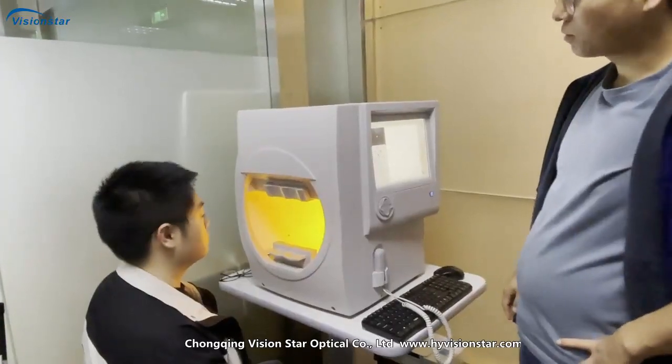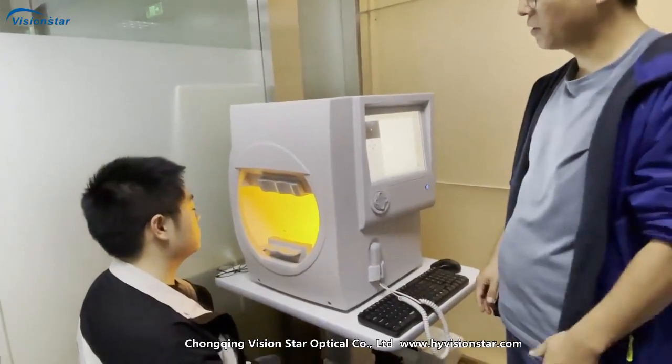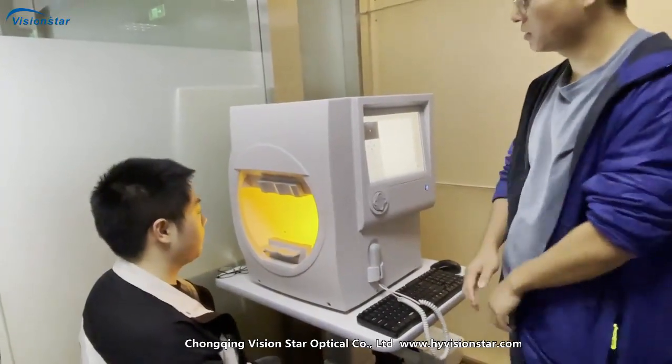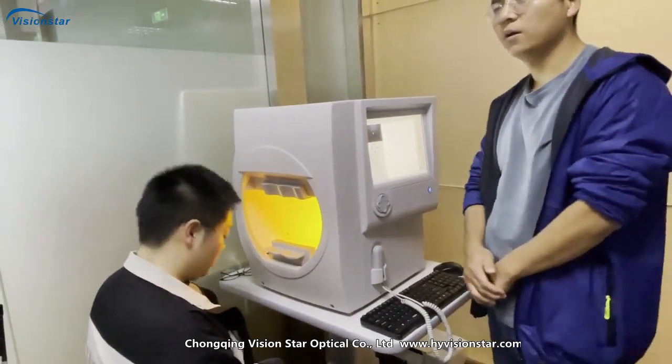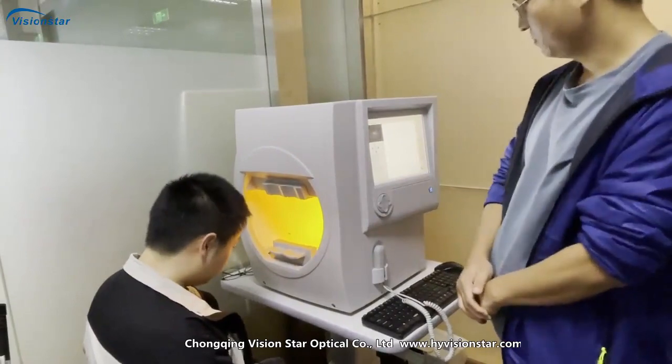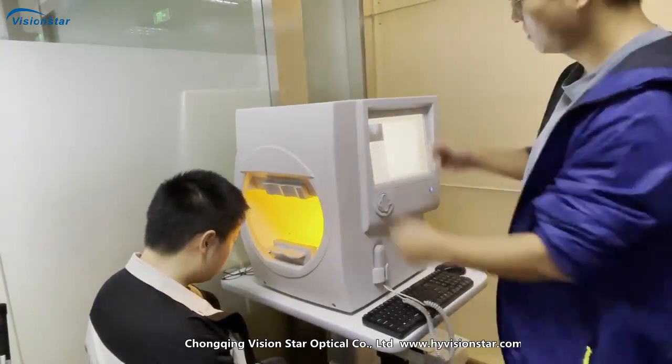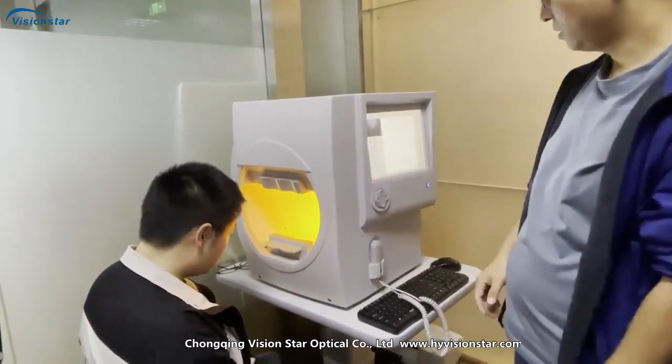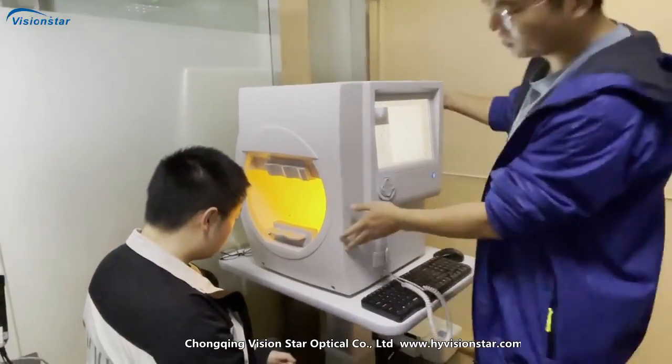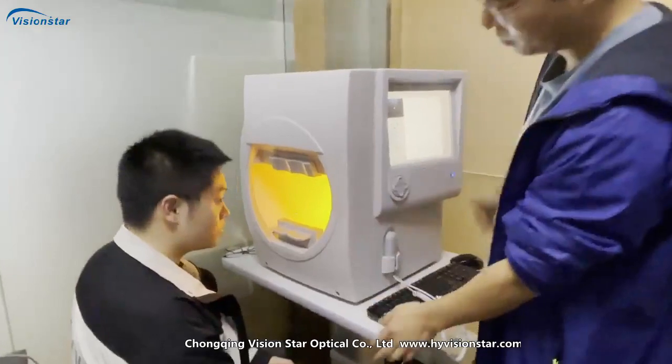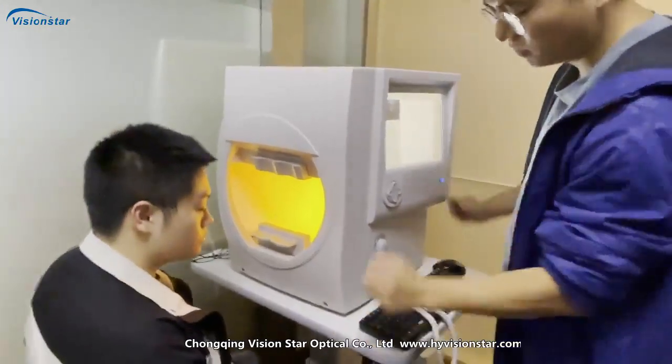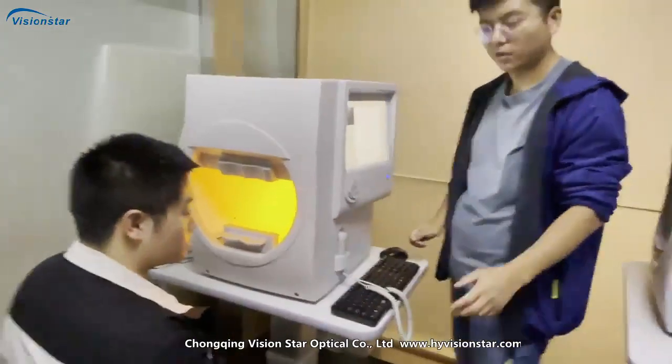Hello sir, this is our projection parameter SK850. This is the appearance, it's not big, you can put it on the table.